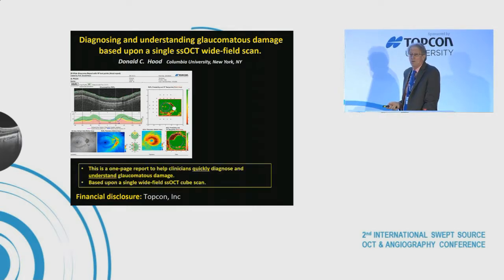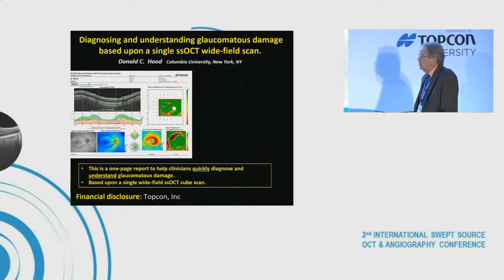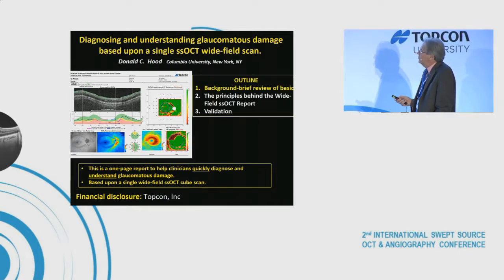So I want to tell you about a 1-page report that we've designed with Topcon to help clinicians quickly diagnose and also understand the nature of glaucomatous damage. And it's based on a single wide field swept source cube scan. So first, a few background information.